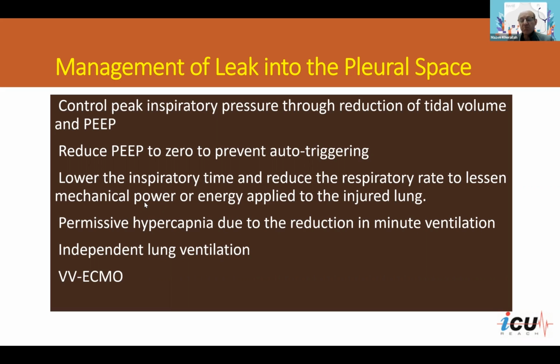However, it might be difficult to do, and the answer to this difficult problem would be ECMO, where you get the circulation outside the body, oxygenate outside and ventilate outside, and bring it back to the patient without going through the lungs, and give the lungs a minimum pressure to heal.